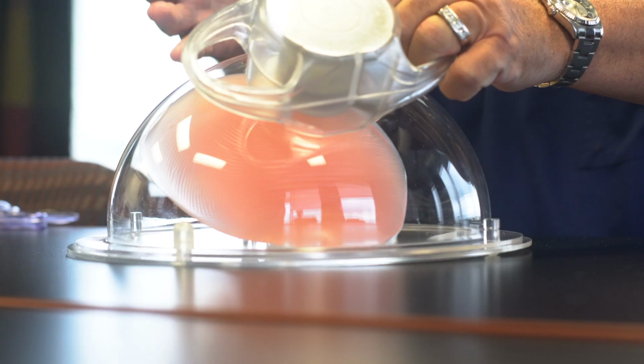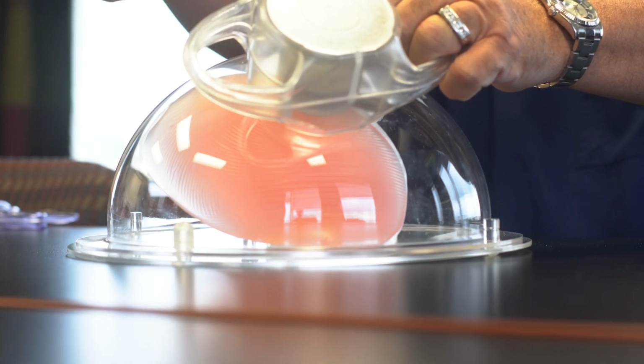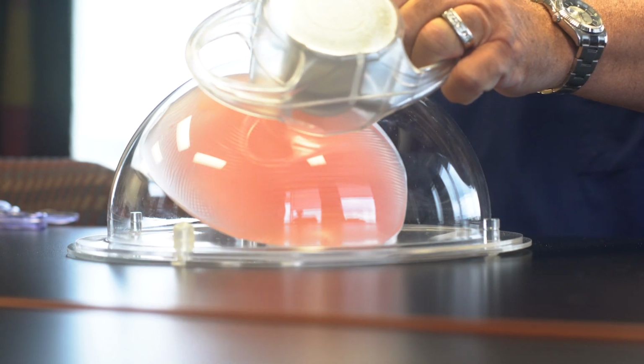So by lifting the liver up out of the way, we can do our sleeve or our band or our bypass here, and we haven't had to put a retractor in. We haven't had to put another incision in. So we're using the existing port sites or trocar sites that we already had.